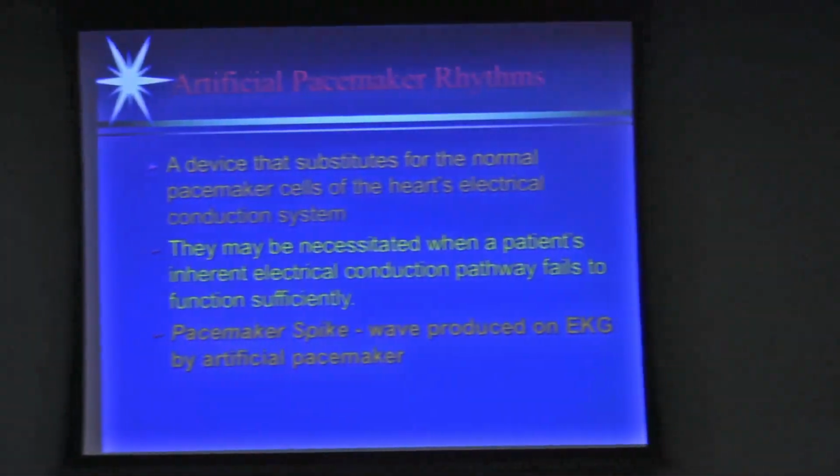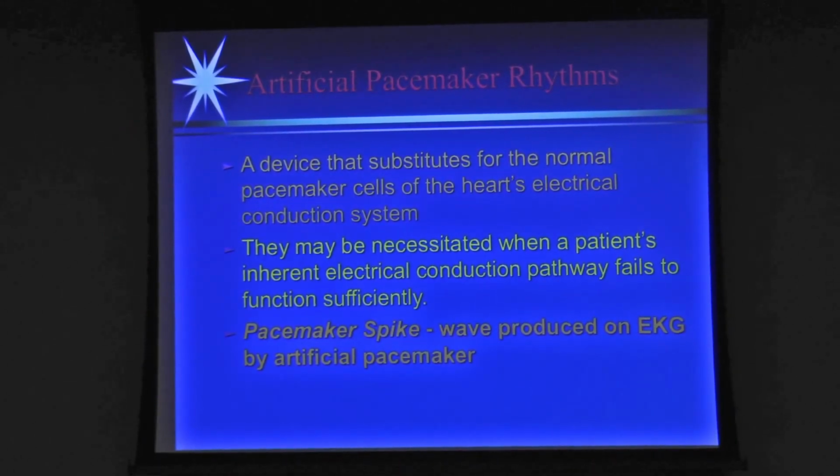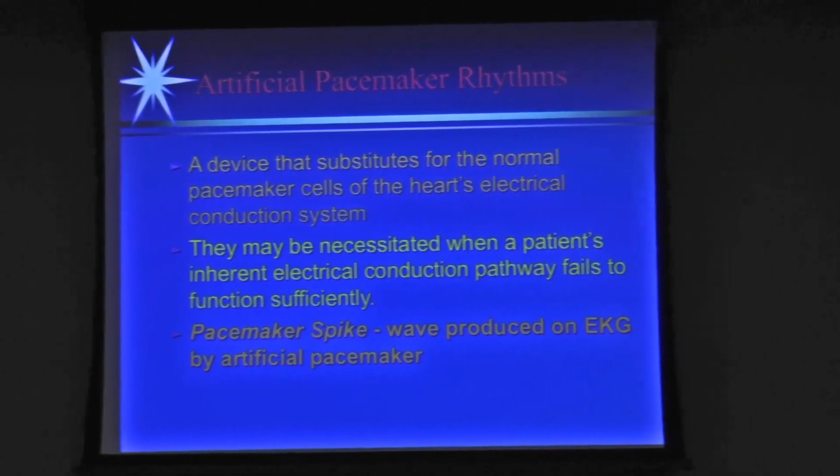So the interesting thing is that when the pacemaker is working, you're going to see something called the pacemaker spike, because what does the EKG show us? Electrical activity. So the pacemaker is firing, there's electrical activity, okay? So that's the only thing. Now I can't tell you how many times I've had people show me rhythms, and you miss the pacemaker spike. And typically paced rhythms are very wide rhythms because again, what do we have? We have a random electrical impulse hitting some part of the heart, and the impulse has to get propagated across the whole heart. So it's a slow depolarization, you get a wide QRS. Okay, so it's worth noting.